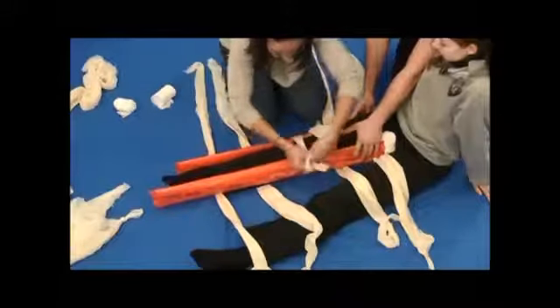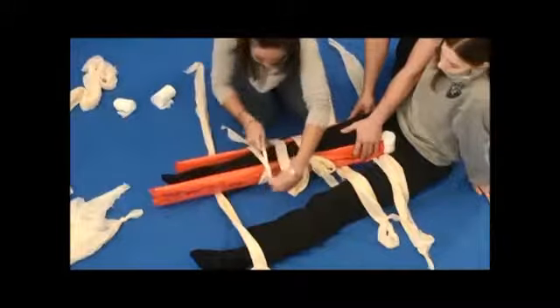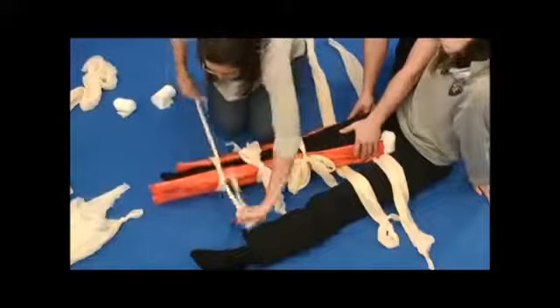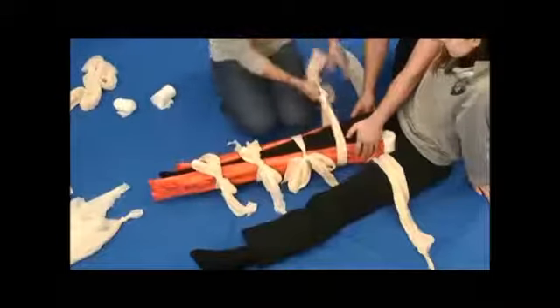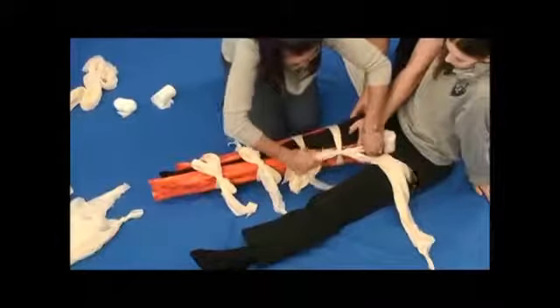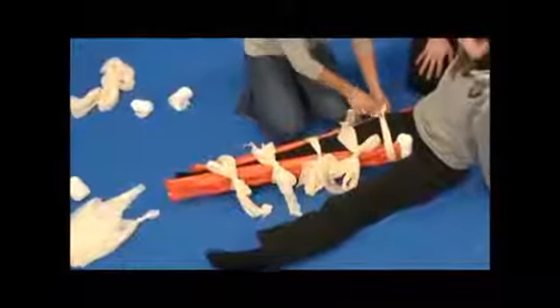Now I'm just going to tie these off. If I were to tie this on my patient, I would need to pad underneath the knot. This one I'm just going to tie on the other side, so it's not uncomfortable for the patient.